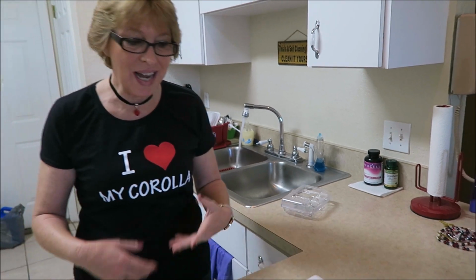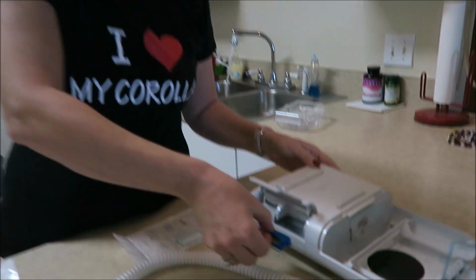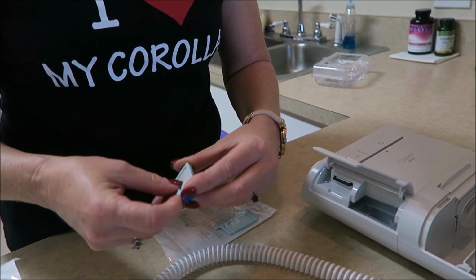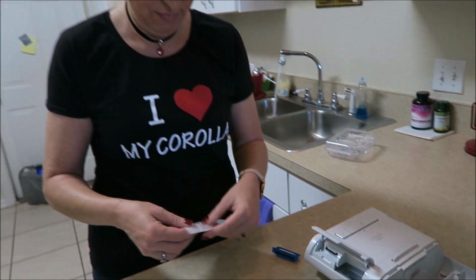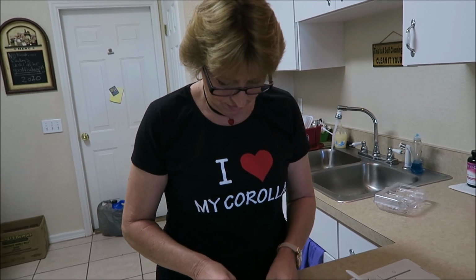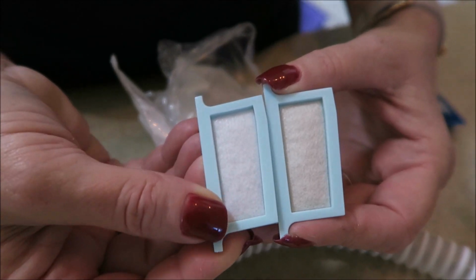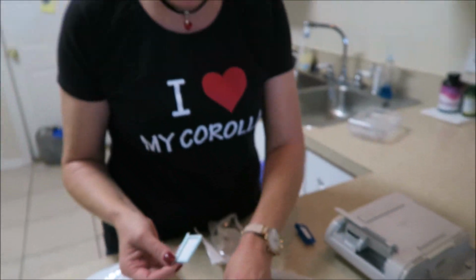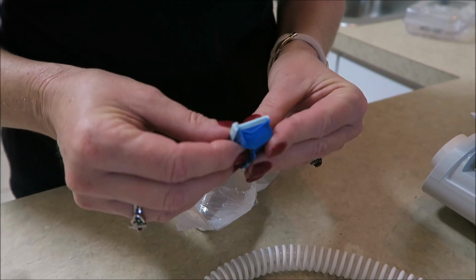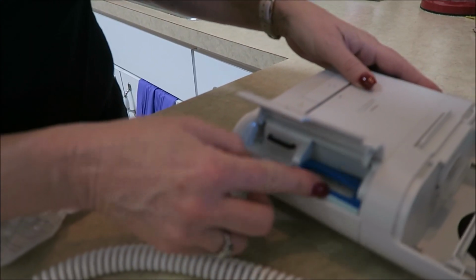Get some hot water running, as hot as you can possibly get it. While that's doing that, we're going to change the filter. If you look at it, it really doesn't look dirty, until you see this. So there is a difference. With this particular machine, you change the filter out every 2 weeks. This just snaps on here like this, and then you just slide it back in there.